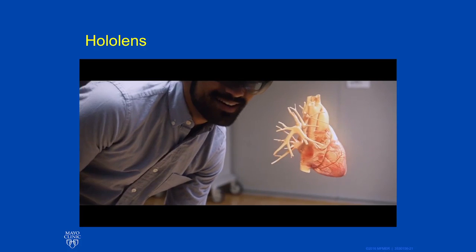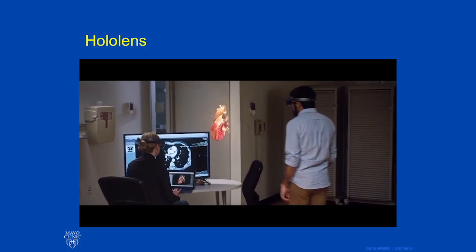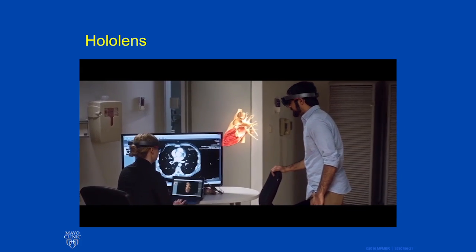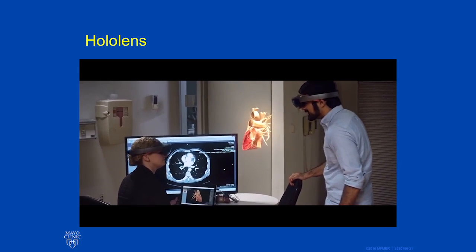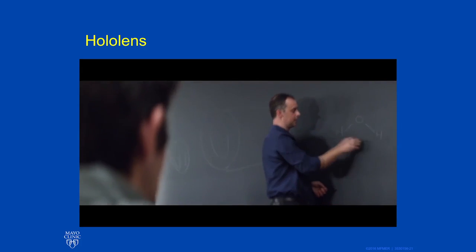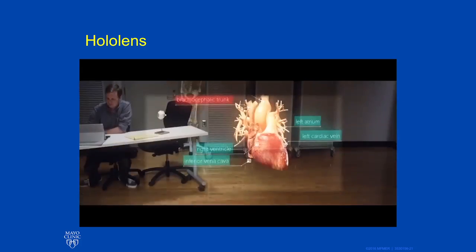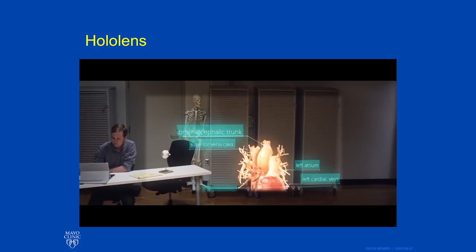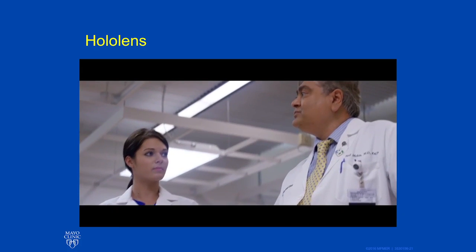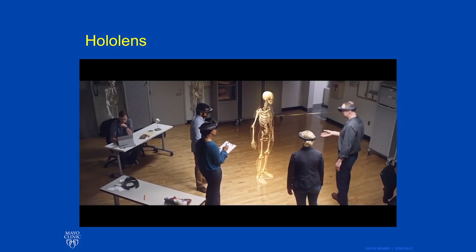The typical use of a CT scan has traditionally not allowed us to integrate an image into our own three-dimensional world. By visualizing the body and the structures of the body in front of us, we can interact with it much easier, visualizing the parts of the human body in a way that it was meant to be. The brain processes three-dimensional images in a much more meaningful way than it would with a 2D view.